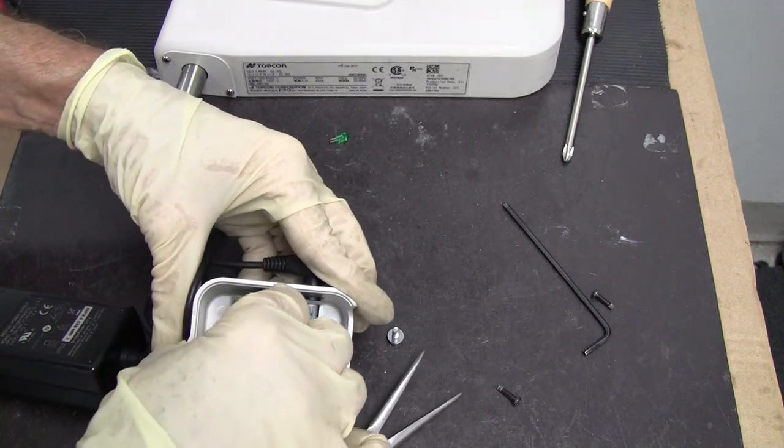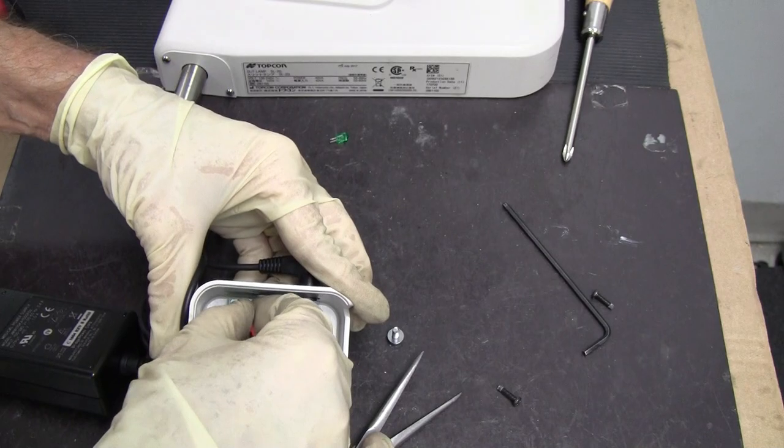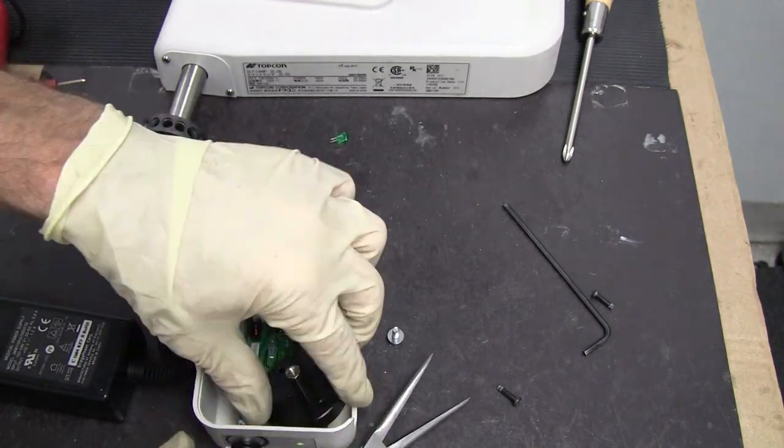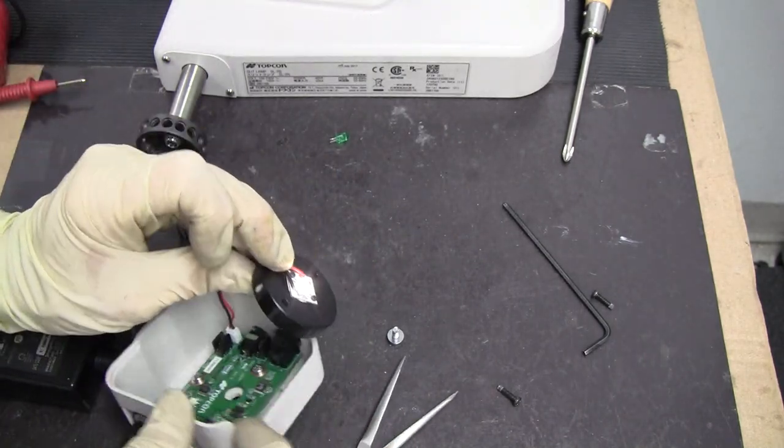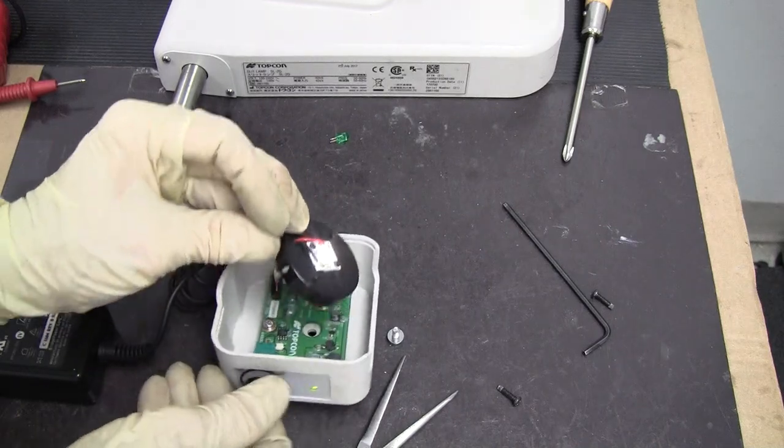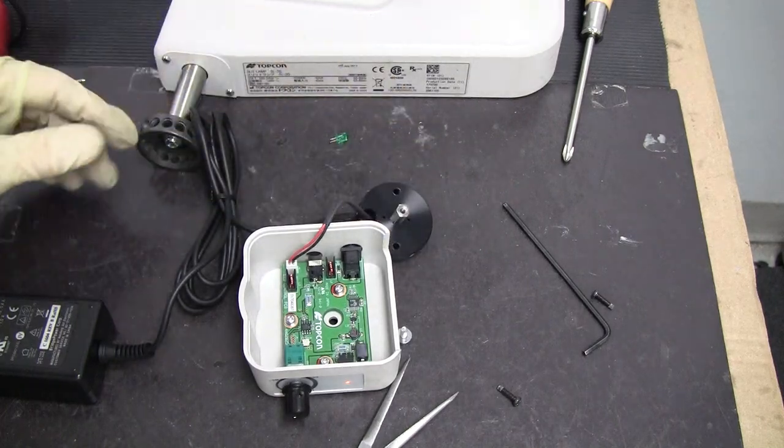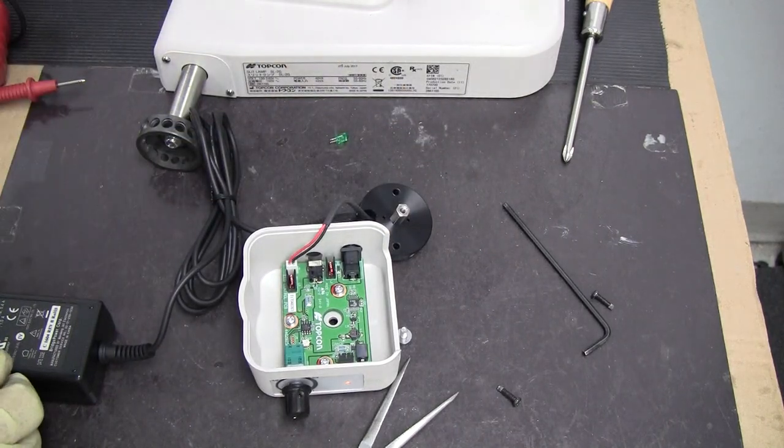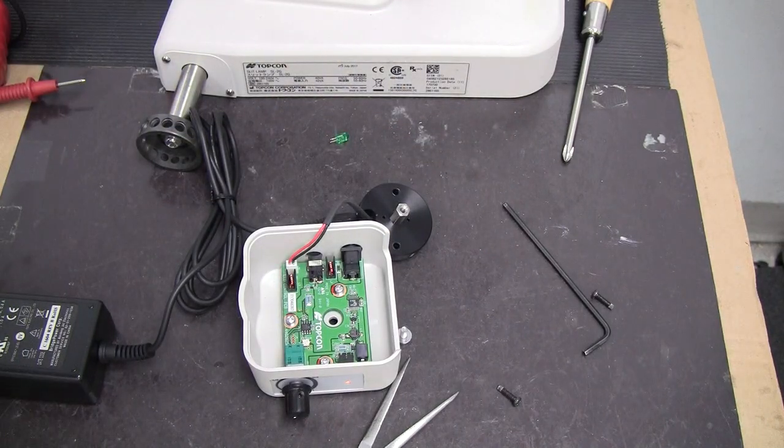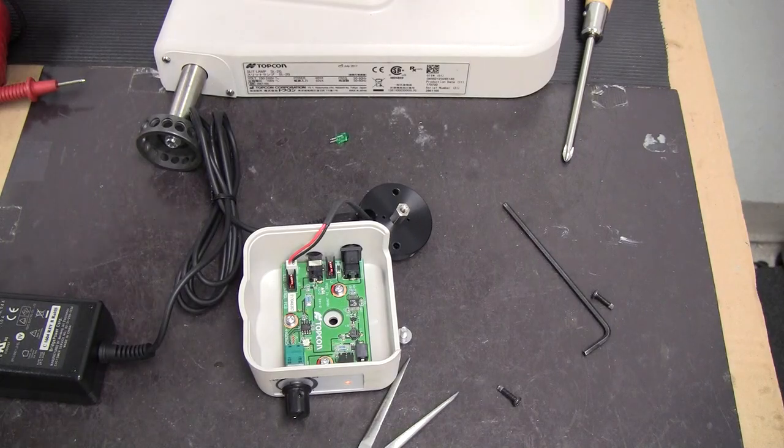If your LED is working, then it should be coming on with the rheostat when the rheostat is turned on. So those are the components of the Topcon SL2G.